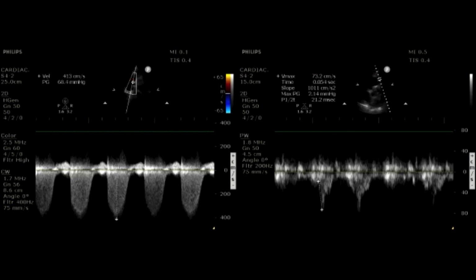Absolutely. So what it's going to impact predominantly is the vena cava size, right? So when you have positive pressure ventilation, the inferior vena cava becomes large in size because there's an increase in the intrathoracic pressure, right? So the increase in intrathoracic pressure prevents the inferior vena cava from filling in the way it would normally do with respiration, right? So you have the opposite. So in patients with the normal CVP, you can have a dilated IVC. And the one time that the IVC size is useful in patients who are mechanically ventilated is if the inferior vena cava size is small, okay? So if the IVC is small in a patient that's ventilated, you definitely know for certain that the CVP is low, okay? If the inferior vena cava is dilated, then all bets are off, and you don't really know what the CVP is. But it should not significantly affect the tricuspid regurgitation velocity.